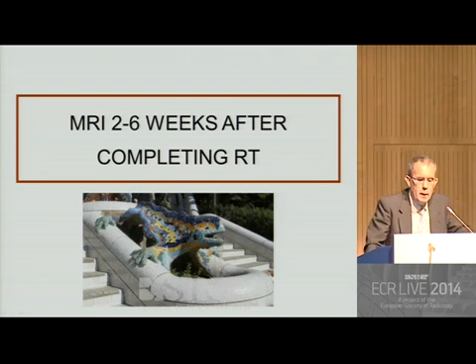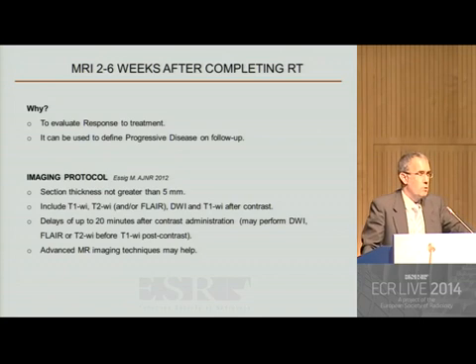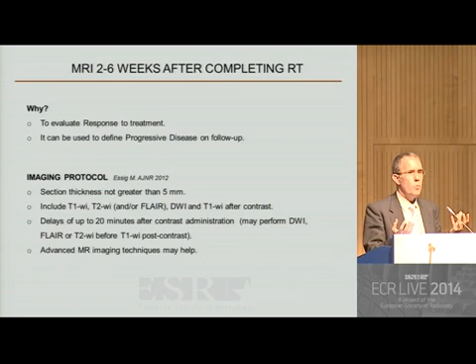Okay, the next exam to be evaluated will be the first exam after radiotherapy, to be performed 2 to 6 weeks after completing radiotherapy. We need this exam to evaluate response to treatment because we are giving a treatment to the patient with chemo and radiotherapy, and we need to know the result of the treatment that we are administering to the patient. Additionally, this exam can be used to define progressive disease on follow-up.